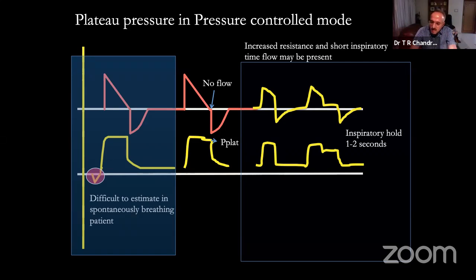The pressure that you have set for delivering the tidal volume and your PEEP, when you add them together, that is the pressure that you are applying to the lung, and that is your plateau pressure. You remember that.